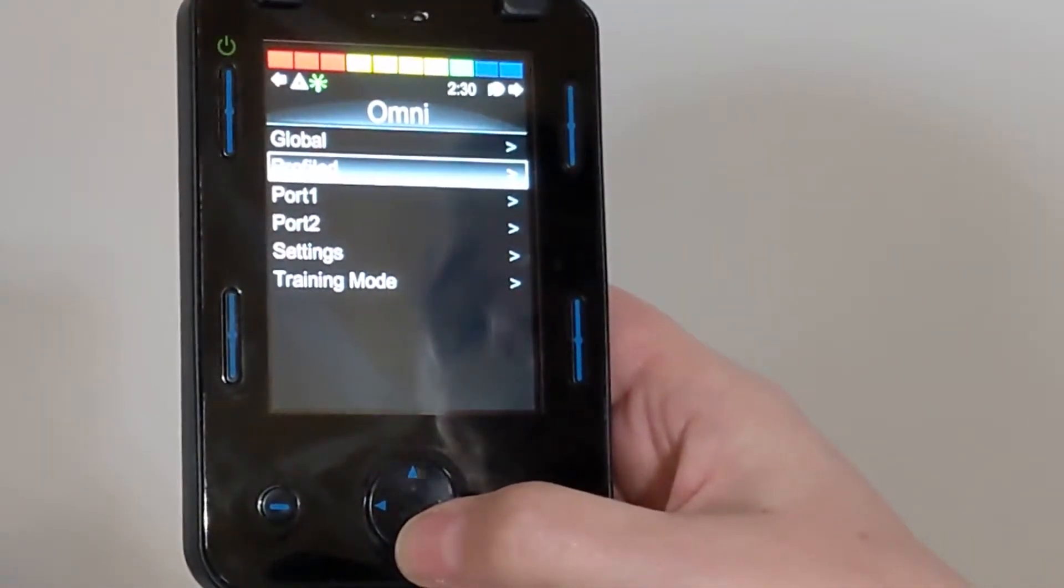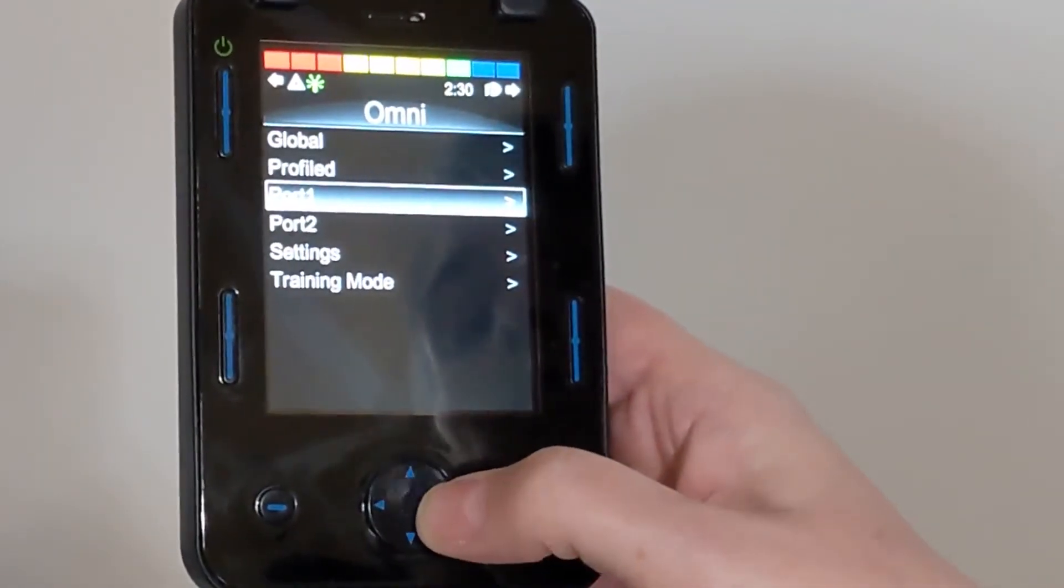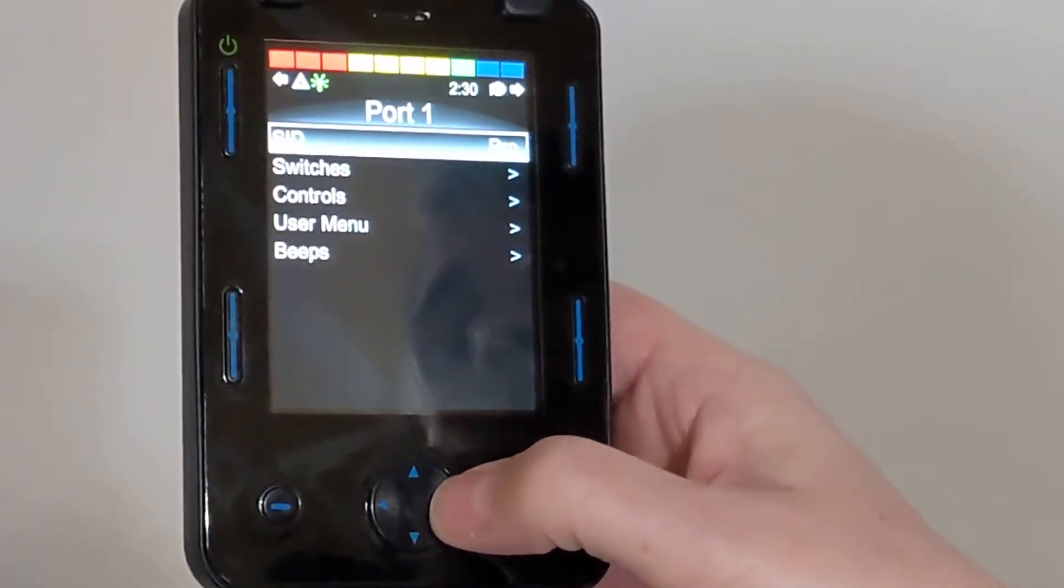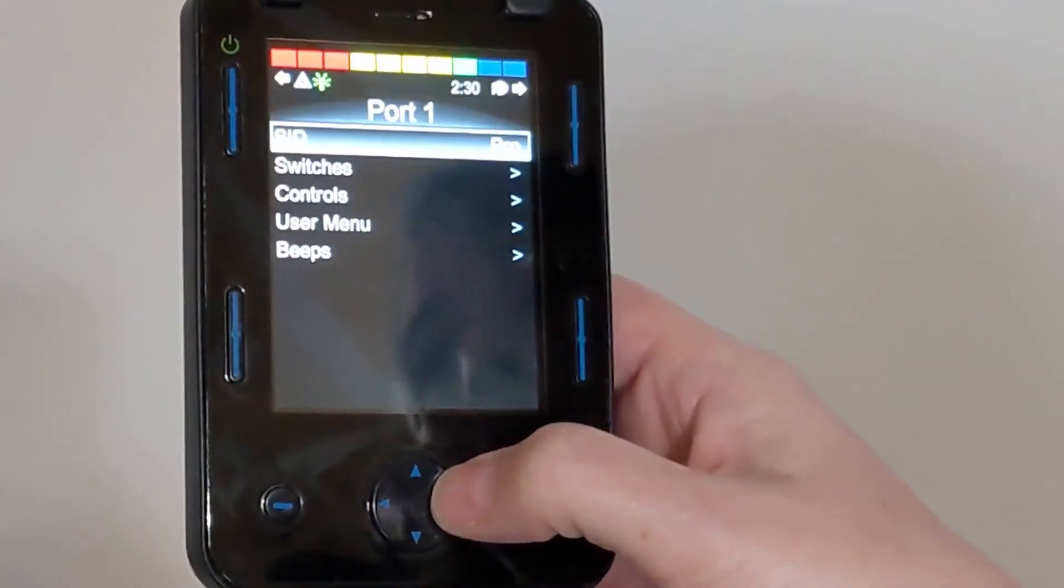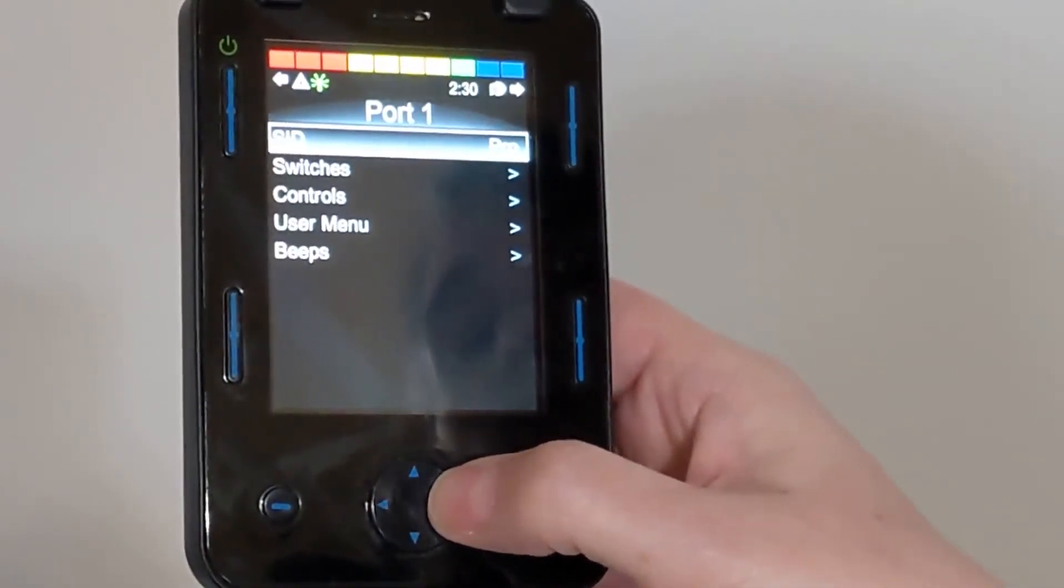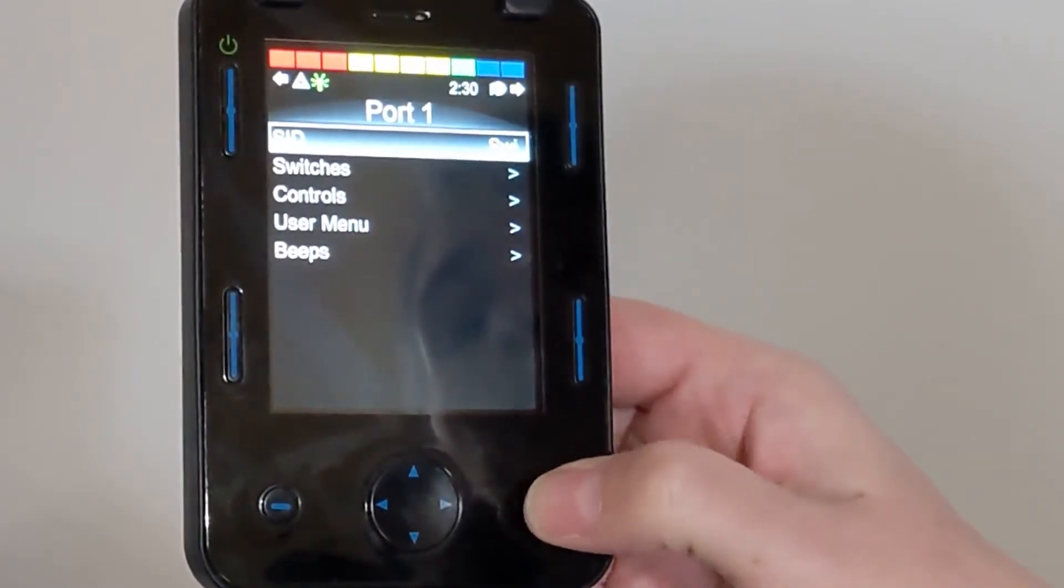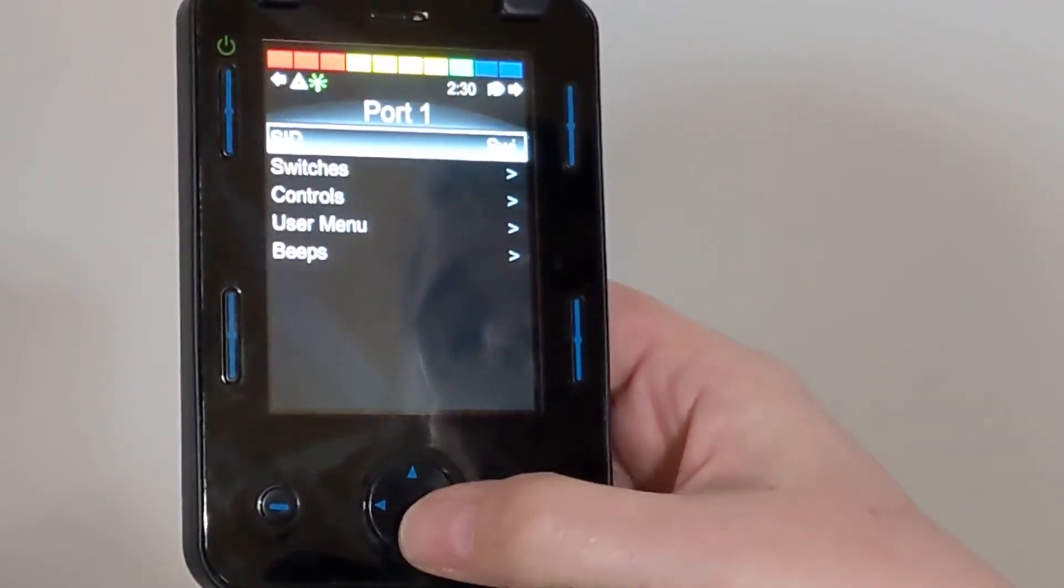Now we're going to go into Port 1, and we're going to change the SID to Switch.